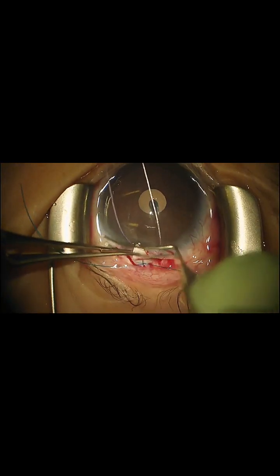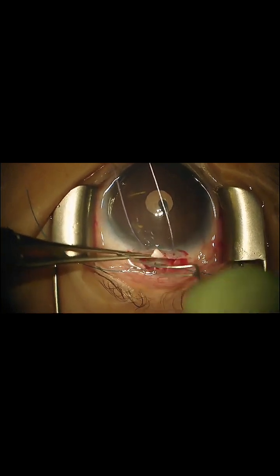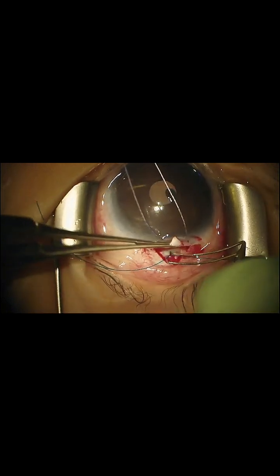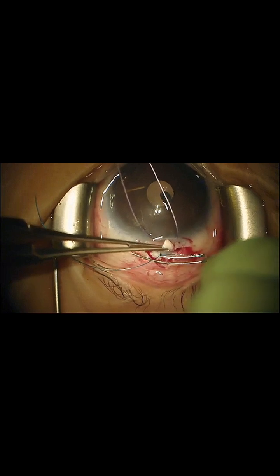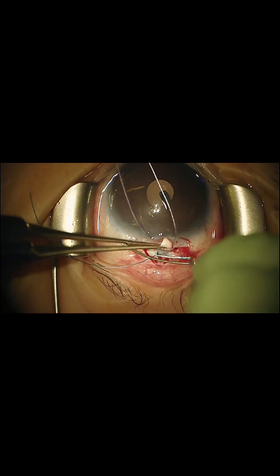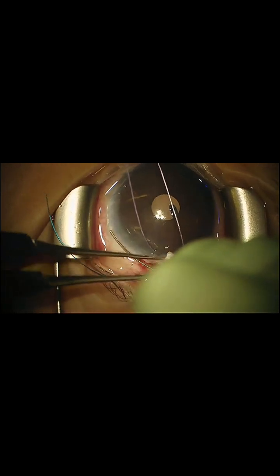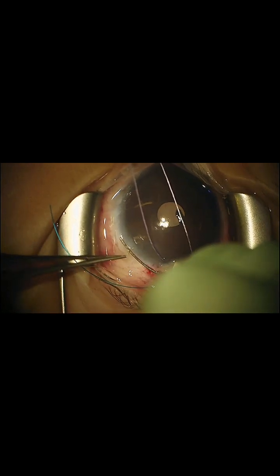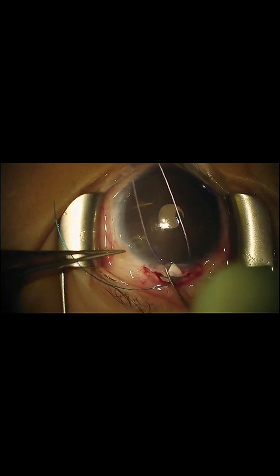So trabeculotomes come in two directions, one to the left and one to the right. I'll show you this one. The other one is a mirror image. You only use the bottom rod. The top one is just to give you reference as to where the bottom one is, because when you rotate this in, you want to be in the plane of the iris. I'm going to rotate it in now, so watch here. Okay, and there's a little bit of blood, which is normal.